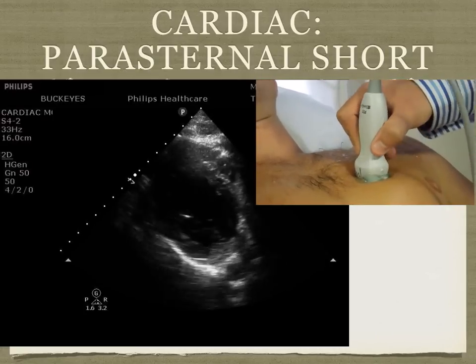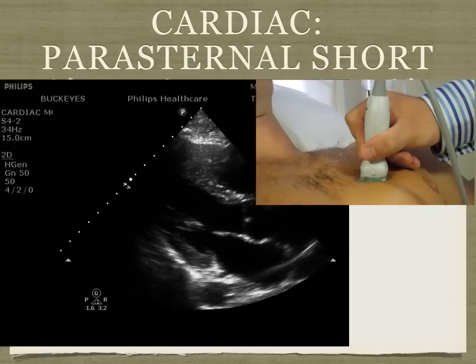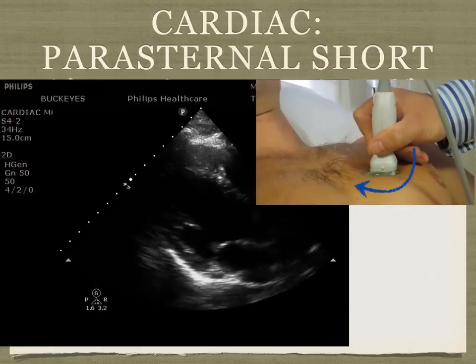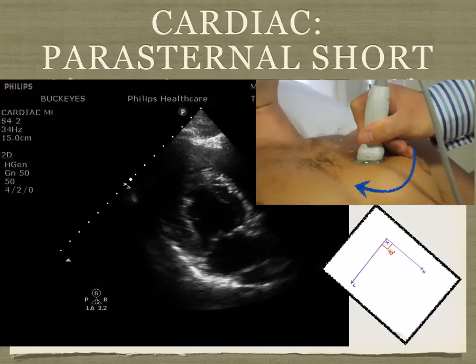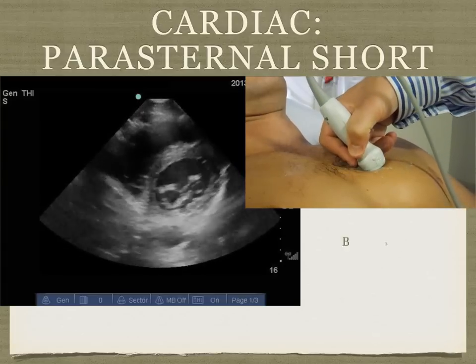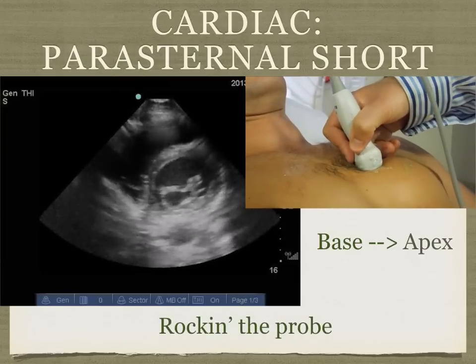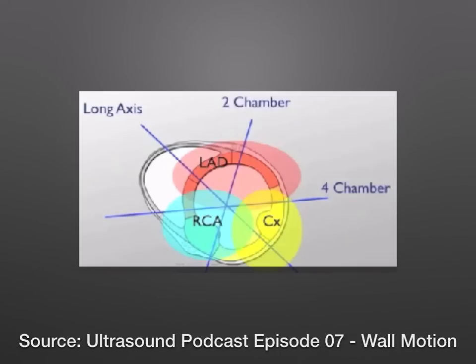Now we're transitioning over to the parasternal short. As long as you have your parasternal long in the correct view, transitioning to the parasternal short is very easy — you just rotate the probe 90 degrees clockwise. After you get the parasternal short, you want to be able to rock through the entire length of the heart, going from the base to the apex and making sure you catch all portions of the heart. That's what we're looking at for parasternal short.